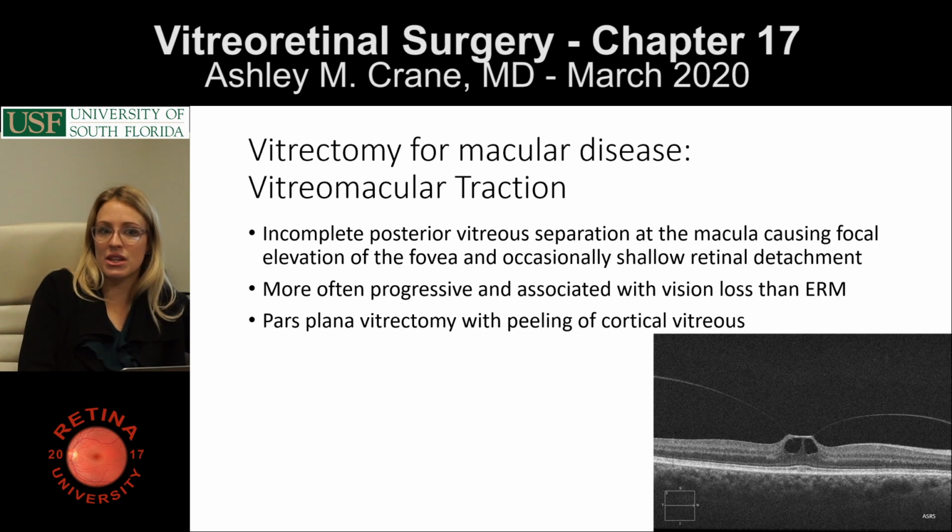So then you're just shaving the peripheral vitreous, and you're pulling on something that is pulling on the vitreous base. Although our cutters are really good, and as the cutters advance, there's less traction placed, and so presumably improved risk, but it should be about the same for the two.